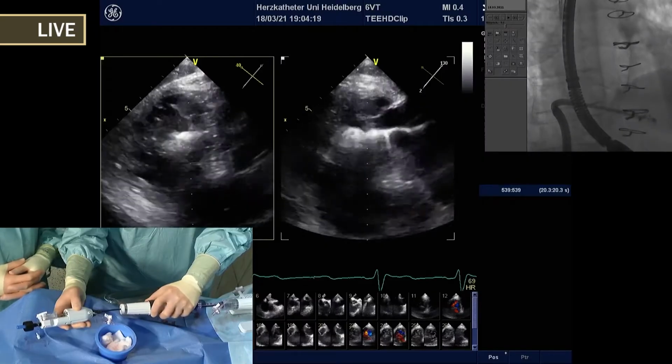Stefan, what is your opinion on the use of ICE in tricuspid cases? We have done a single-digit number of ICE cases. Actually, in patients with a mechanical aortic and mitral prosthesis, ICE is very helpful because otherwise you only have a deep esophageal and a transgastric view to visualize the tricuspid valve. So in these cases, actually ICE may be beneficial.